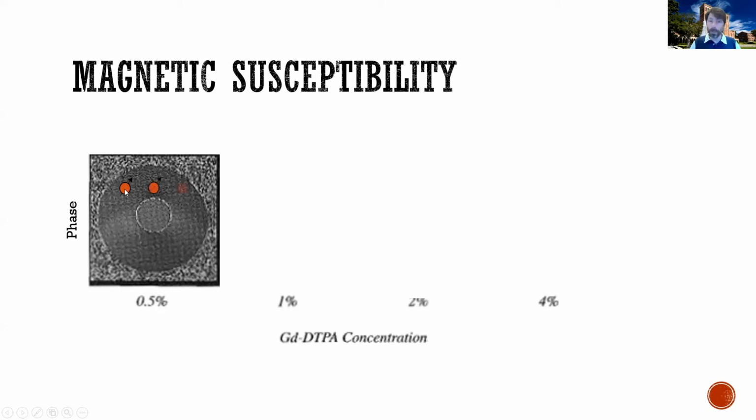Now, let's imagine that we have multiple protons. Look at where they are in the field. They kind of all are in a similar part of the magnetic field, right? They all are over sort of this kind of dark gray area. So probably these protons, for the most part, all have the same Larmor frequency. They're all resonating at the same Larmor frequency, which is why they're all the same color, the same shade of orange.